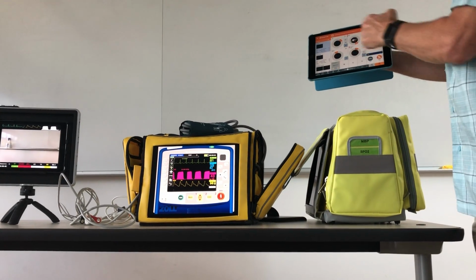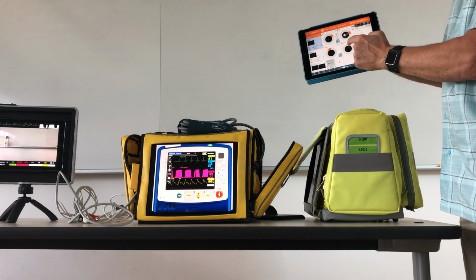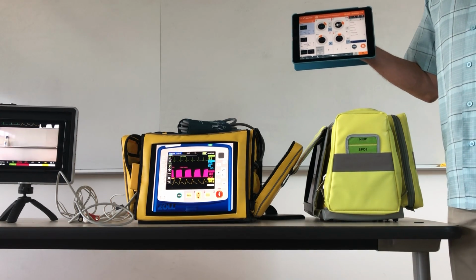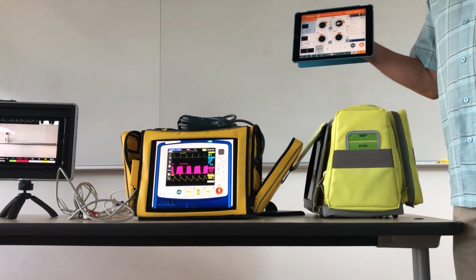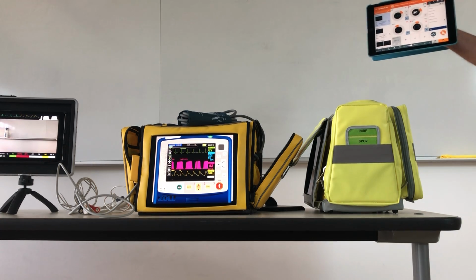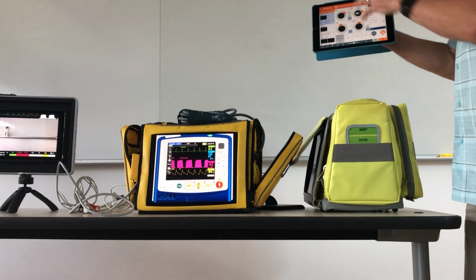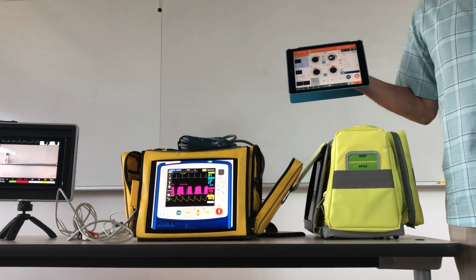The waveforms, so the dials on all of them, that's how you control. Blood pressure, you can just dial up and down. Capnography, and there's a little toggle switch. So respiratory rate and the CO2 are on the same little dial. You just have to toggle which one you're changing, which trips everybody up for a while because you think you're changing the end-tidal CO2 and instead you're making the respiratory rate 48. But as long as you pay attention, the dials are what affect the change, and as soon as you've made a change, you hit send to send it to the monitor, and then they see it.